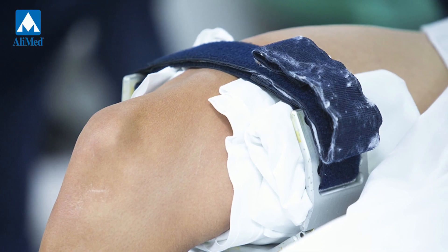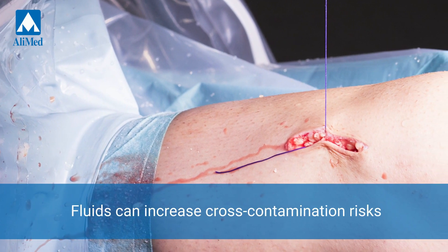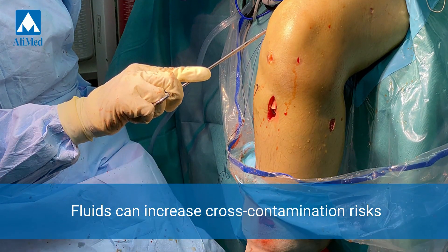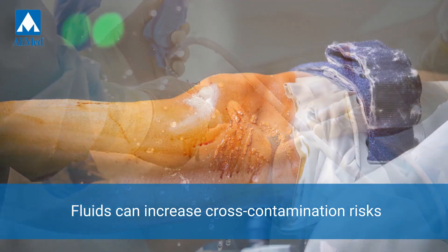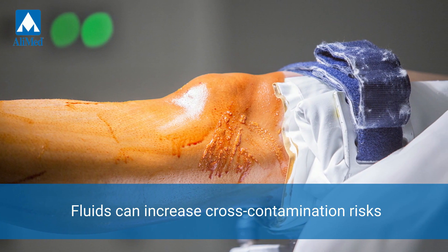Cross-contamination in the OR can be expensive, dangerous, and can lead to serious, or even deadly, never events. Arthroscopic leg procedures usually involve blood and large quantities of saline, which can infiltrate seams and hardware openings in the device's use, increasing cross-contamination risks.